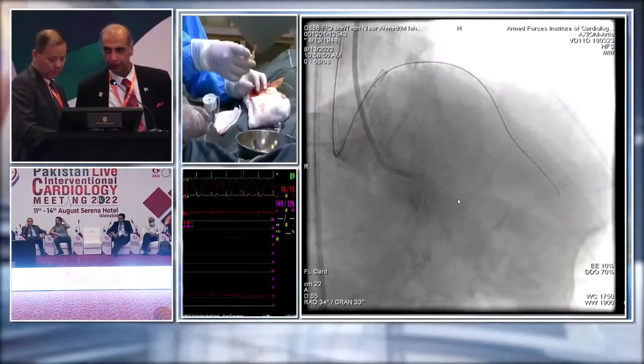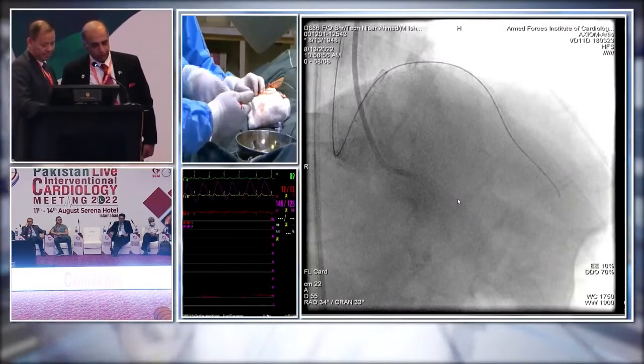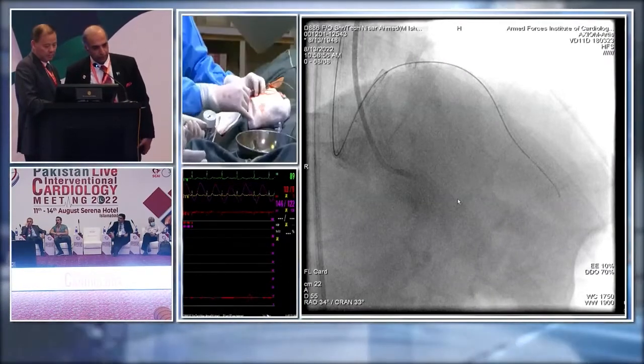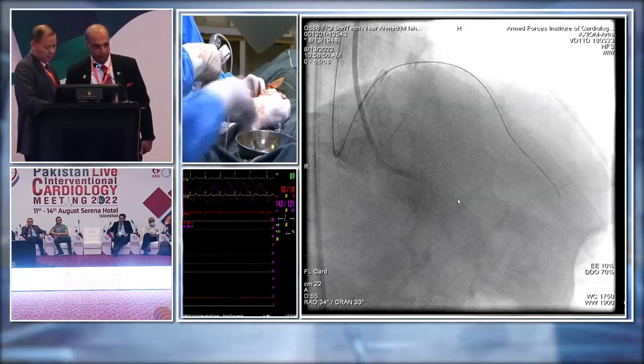You see, we don't very frequently use these trapping balloons over here. We usually use the inflation device, keep the pressure up, and then use it. Fine. So what is your take? What is your common practice over there? For us, this is basically economics.